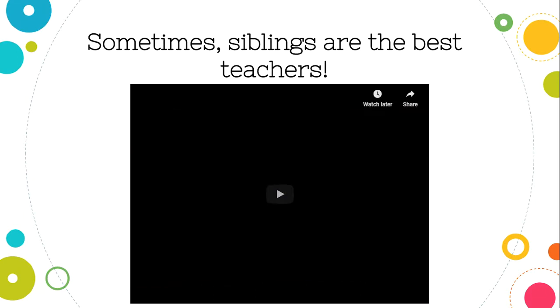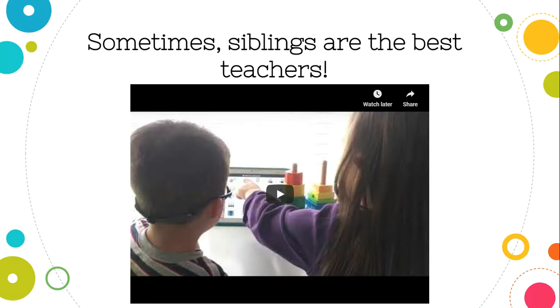So you see they're just playing together with the stacking toy, and she's just modeling top and bottom. So simple words, she's not doing anything very complicated. So easy to hopefully incorporate siblings if your child has any, or if you have any additional children.